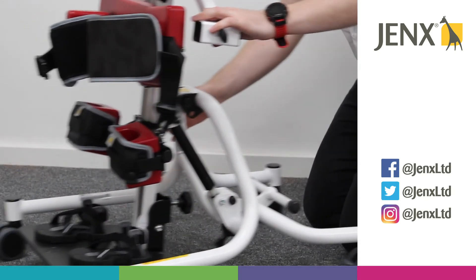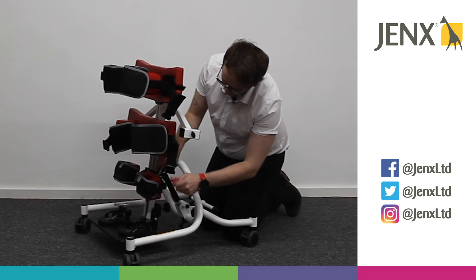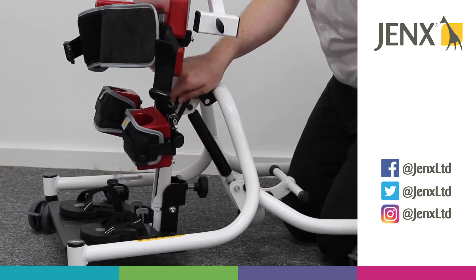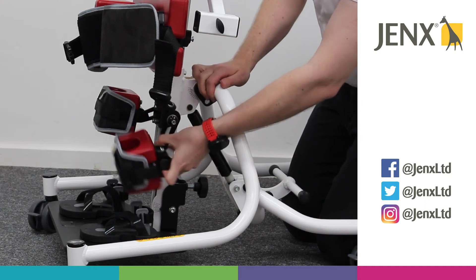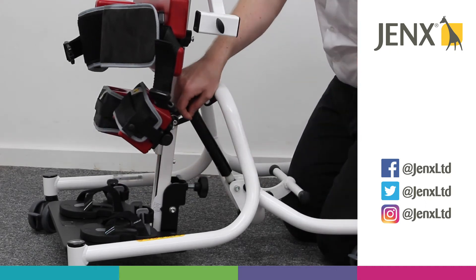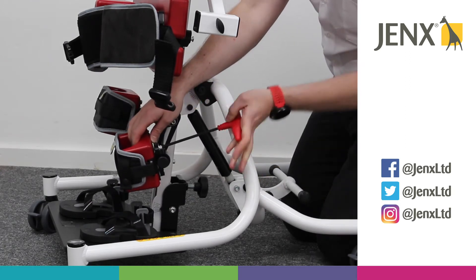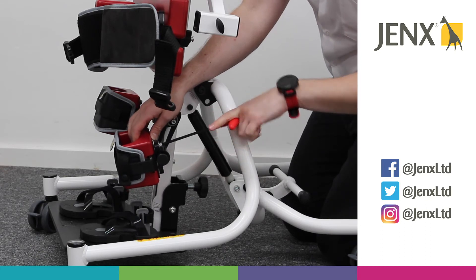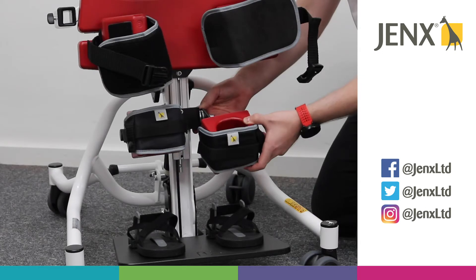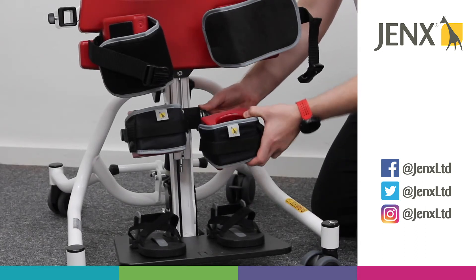Now if you want to change the angle of the knee cup, we've got one Allen key adjustment here. So if we loosen that off, we're then able to move the knee cup wherever we need it to be. We can also loosen the top Allen key here, and what that does is allows us to angle the knee cup however we might need to.